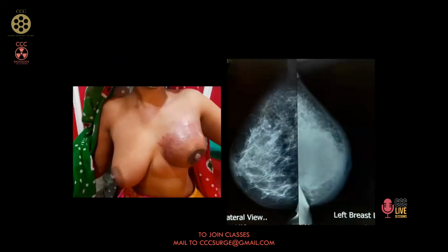We were talking about density of the lesion. Now look at this. All of you know, this is an inflammatory carcinoma. Now look what it does. You look here, there is a thickening of the dermis, the whole dermis. Now look at this. This is clear, but here you find that it is completely dermal thickening, and the nipple is drawn inside. It touches the prepectoral muscles, and this is how the density increases. There is dermal thickening, and the nipple is indrawn and can be visible even in a mammographic plate.